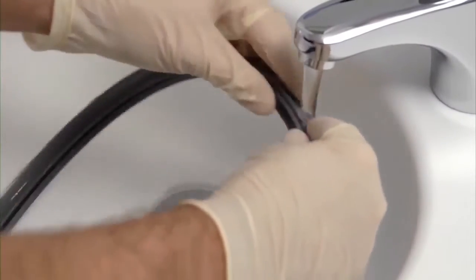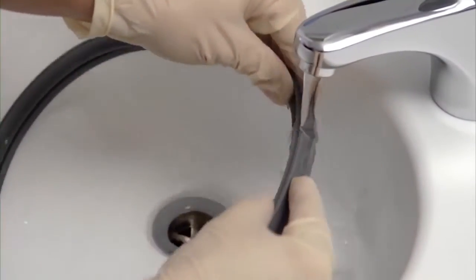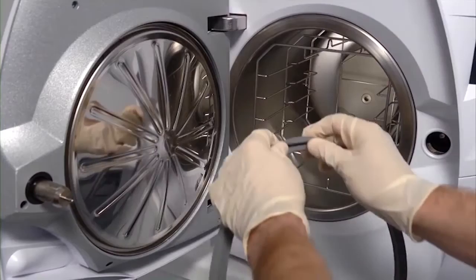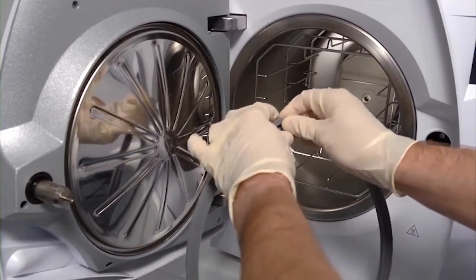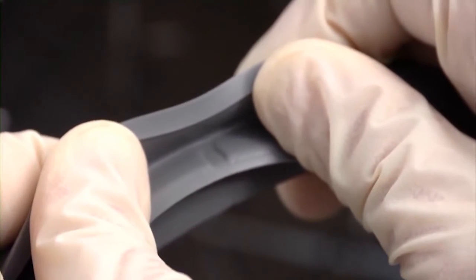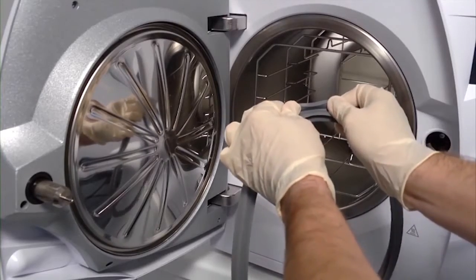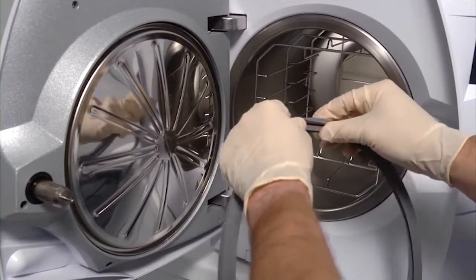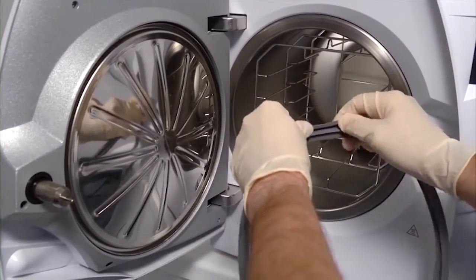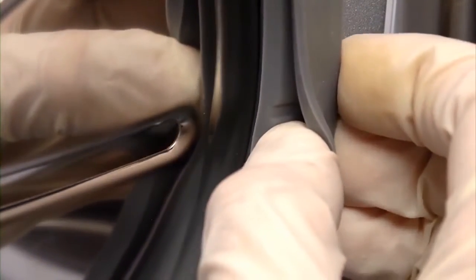Before fitting a new door seal, it should be moistened with water to aid seating it into the correct position. Within the groove of the door seal, there are four markers at the 3, 6, 9 and 12 o'clock positions. These markers will help you to fit the door seal correctly without overstretching it. The markings on the door seal can be matched up with those found on the porthole to aid fitment.